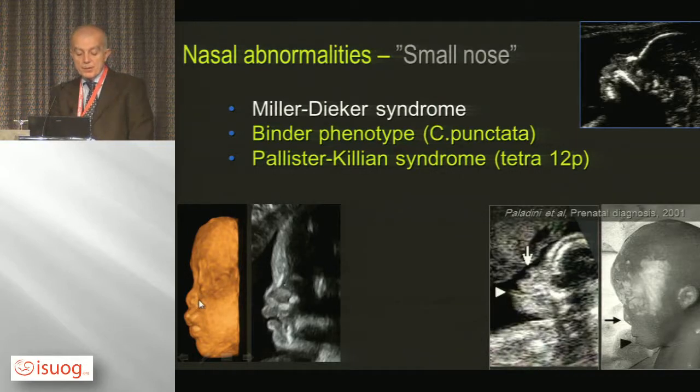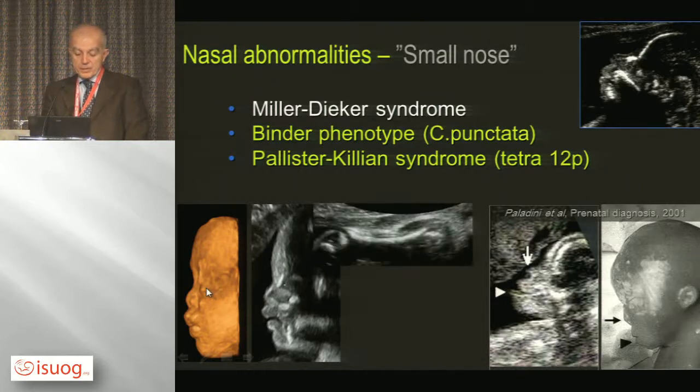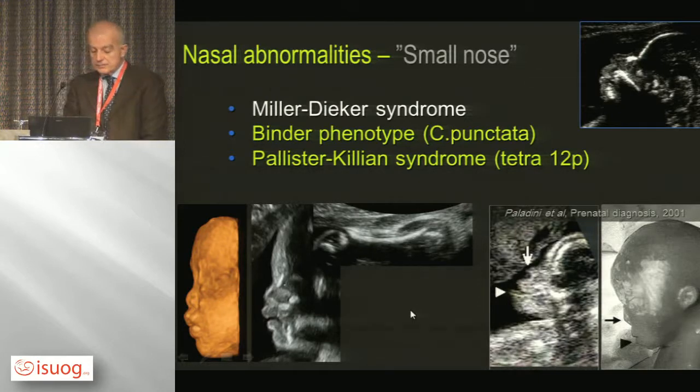you have a mid-face hypoplasia consistent with the diagnosis of Binder phenotype or Binder abnormality, you should consider that this is a benign condition, unless in the 3rd trimester you may find evidence of stippling of the epiphysis of the bones, which is consistent with the diagnosis of chondrodysplasia punctata.